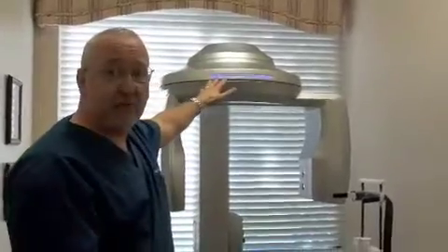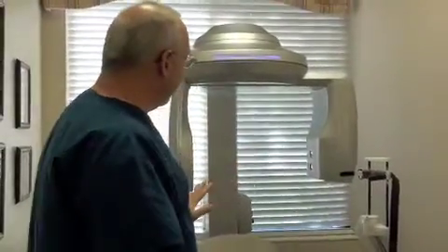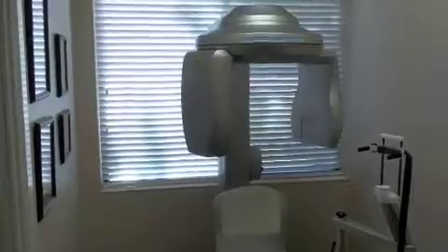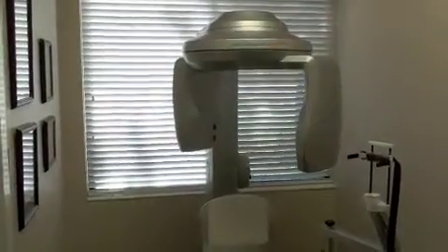It has all of these motions to control its location as it's taking the image. We just hit perform scan. There it is — it's doing its motion. There we go. Oh, look at that beautiful thing. So what kind of information does that give us? This is the really cool part.